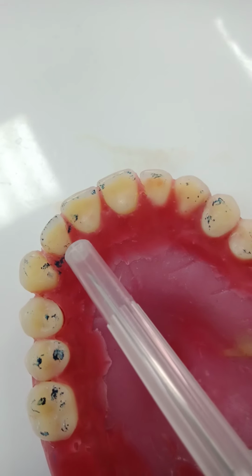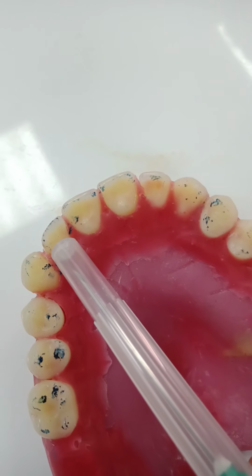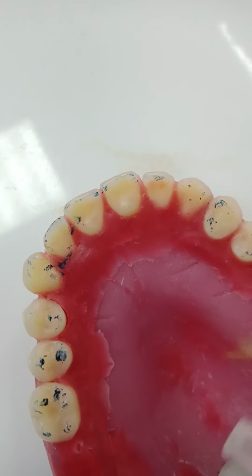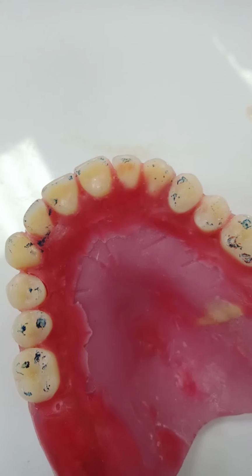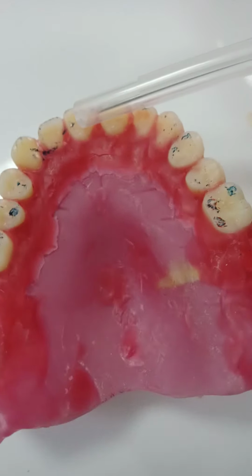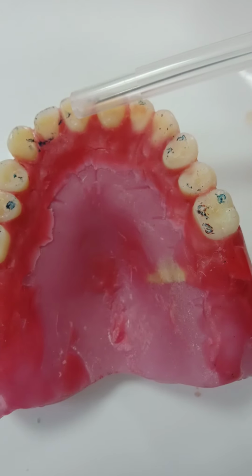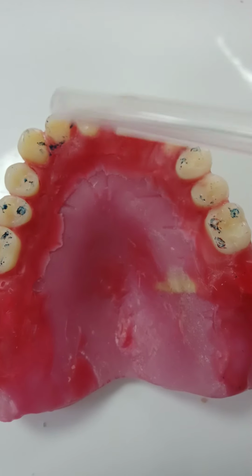Now in wax, we have a dislodgement of the tooth, but in dentures, we will have a dislodgement force fulcrum where it might produce a reduction in posterior retention. You know how that works. Because if we flip the denture like this, what will happen to the posterior? It goes upwards. So I'm reducing the posterior retention.